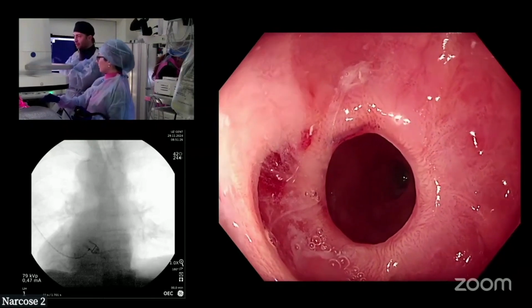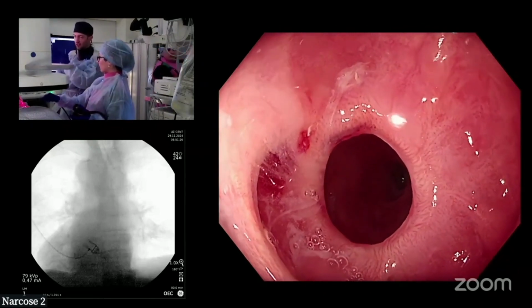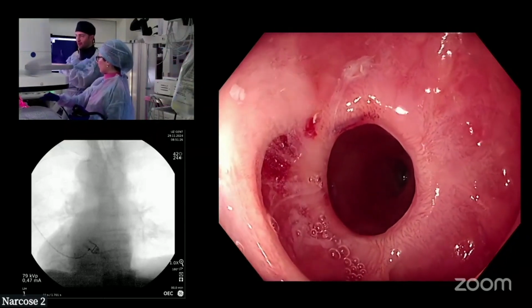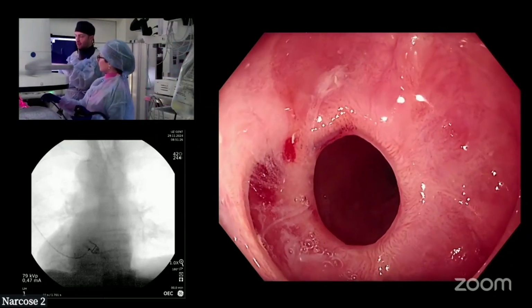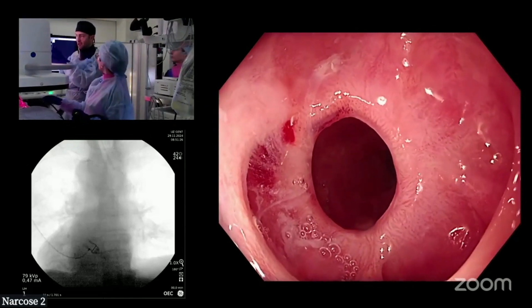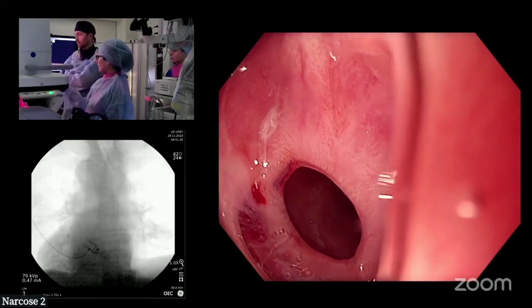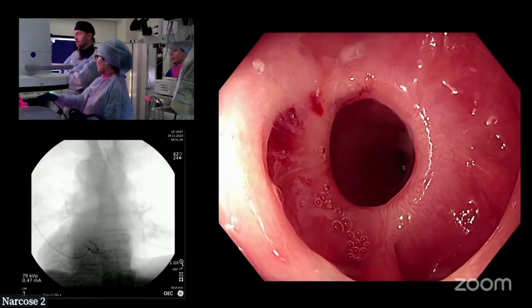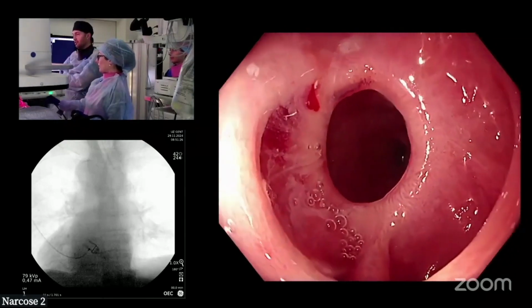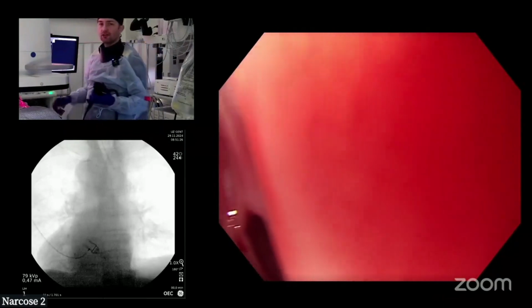One other interesting thing about this stenosis, and something we should mention to the audience, is that it has quite a fibrotic component. And maybe if you take a dilating balloon, it will tear in a particular orientation. And maybe it's quite good for incisional therapy. Yeah, and that's what I wanted to ask. I think so. It seems really quite fibrotic. Let me just have a second so I can show. I would like the needle knife please.